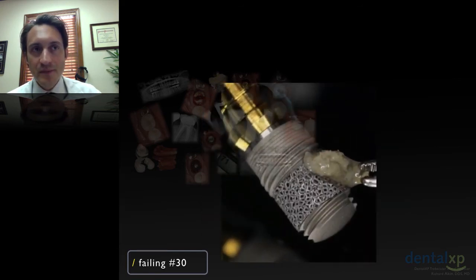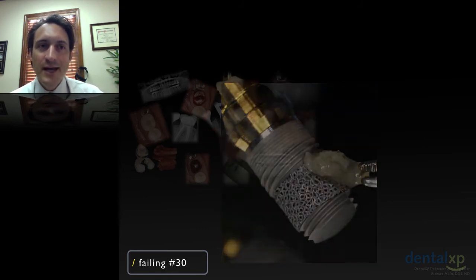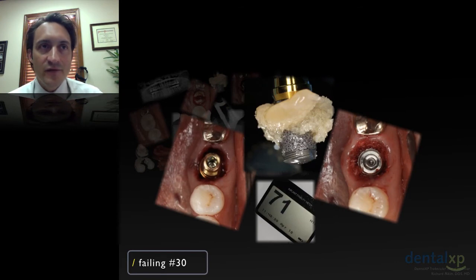Now let's move on, and here's the implant. And this is a 6 millimeter by 11.5 trabecular metal implant. And this is, I think I have mentioned, made by Zimmer. And this is the fraction 3 of the PRGF and I'm applying this to the implant. And in this case, I actually also wrapped the implant in the PRGF and used the implant again as a delivery unit for the PRGF and the particulate bone.